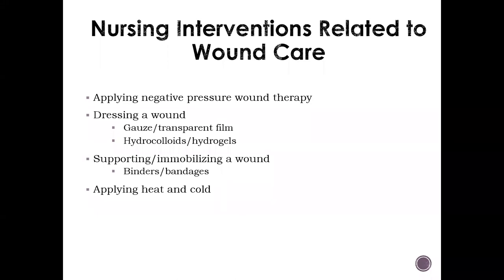And then we have gauze dressings. So some gauze dressings are impregnated with antimicrobial agents, medication, or moisture, and others contain petroleum to keep the wound moist. Gauze can be a combination of saline and medication. Gauze dressings can be used for packing large wounds, cavities, tracts, deep or dirty wounds, or heavily draining wounds.